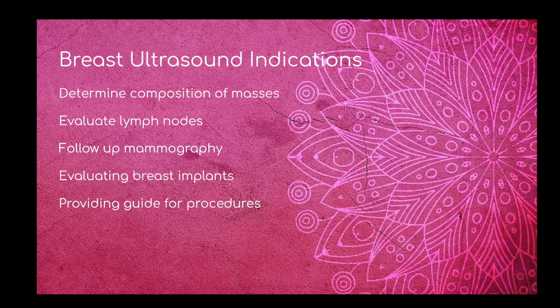Now, why do we do breast ultrasound? Probably the biggest reasons that we are going to do it are, first off, for a palpable mass. The patient did their yearly exam at home, or they came in to their yearly exam at the GYN office and had the breast palpated for masses, and they found one. Or it's to follow up a screening mammogram that turned diagnostic. Those are probably the most common reasons that I've done breast ultrasound.